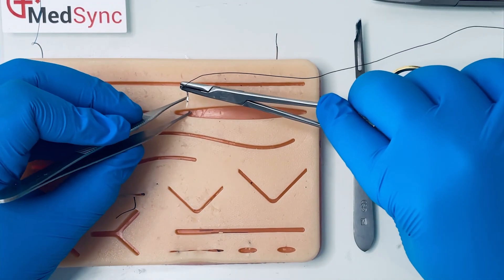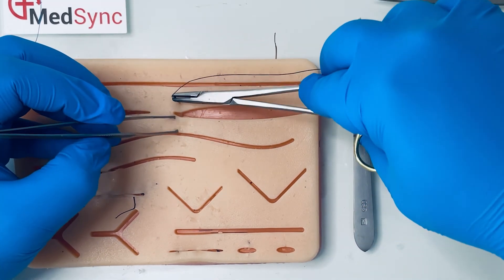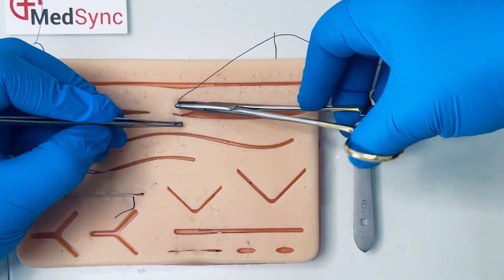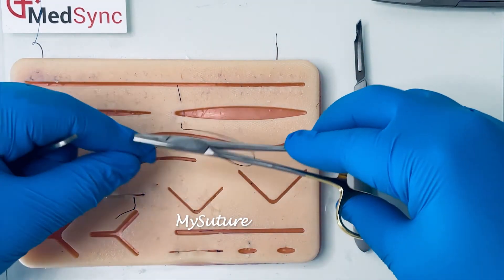In this video we are demonstrating easy techniques to close a wound under tension without layered closure or lots of different types of sutures. Here we are using a MySuture 3-tier skin simulator.